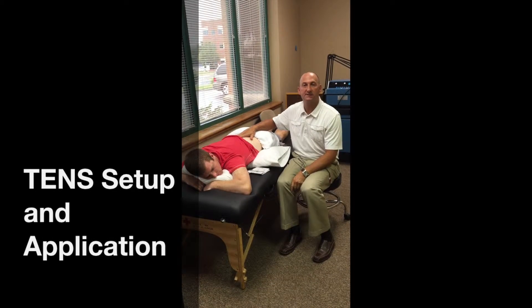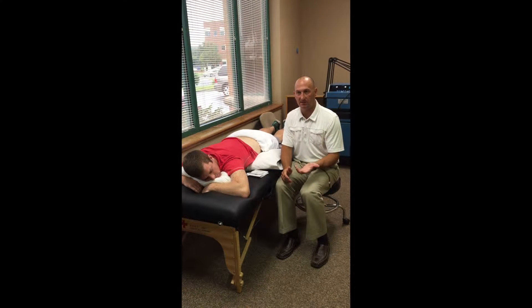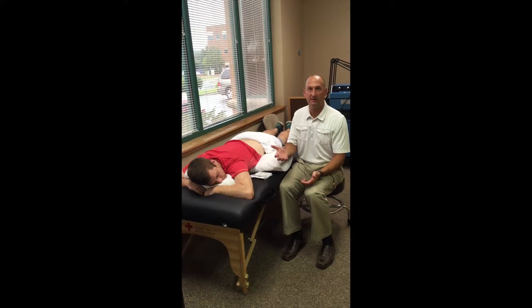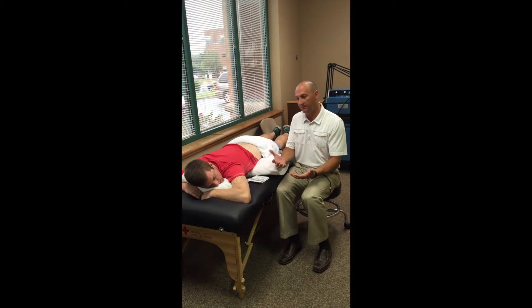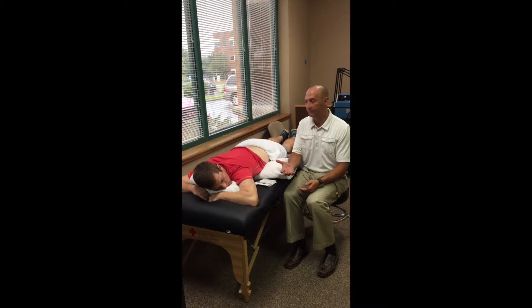Next we're going to go through just the setup for a TENS unit. The first thing when you're going through your lab practicals, I always want you to ask the patient is, how are you most comfortable? We have to think about if they're going to be on a modality for 10, 15, or 20 minutes — we need to make sure they are in the most comfortable position that still allows us to apply the modality and get the desired effect with the tissue.